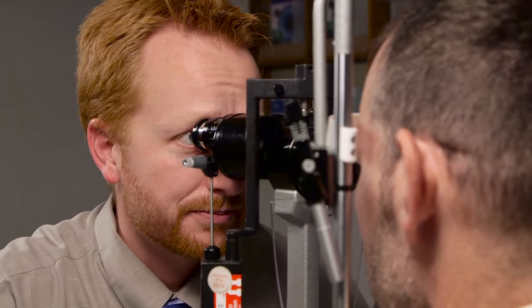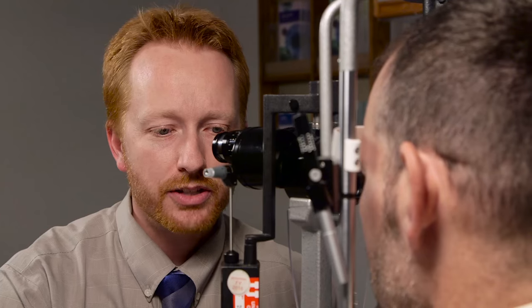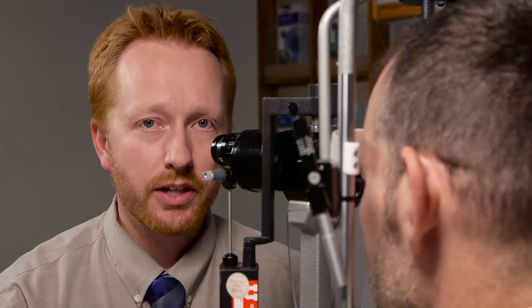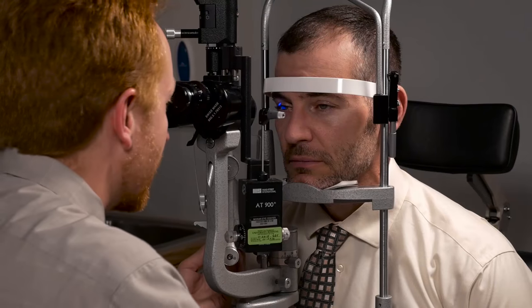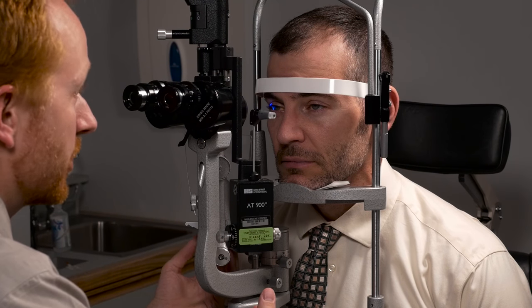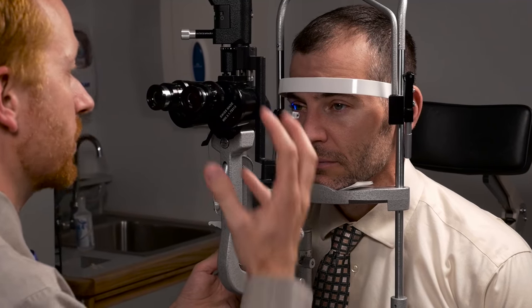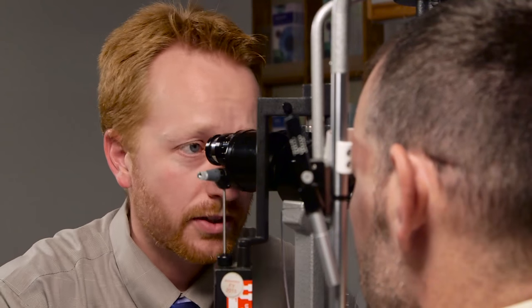As I assess the contact lens, you look for a number of things. Is the contact lens centered? At the center of the cornea, is there touch on the cornea or is there clearance — meaning space between the front of the cornea and the back of the contact lens? An ideal fit is an alignment fit, which means the lens just very lightly touches the front surface of the cornea in a very evenly distributed way. You also have the patient blink so you can see how much the lid pulls up on the contact lens or moves it around. You don't want too much movement, but you want enough so that tears can spread on the front and back surface of the contact lens.